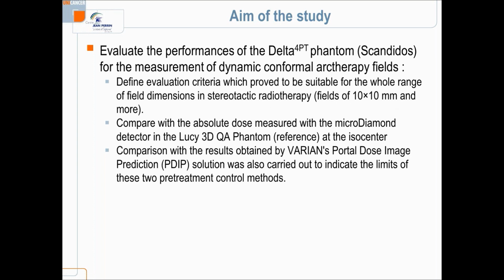We also compare the dose measures with the Delta4 to the absolute dose measured with the microdiamond detector in the Lucy 3D QA Phantom, and to the results obtained by the Varian portal dose image prediction algorithm.